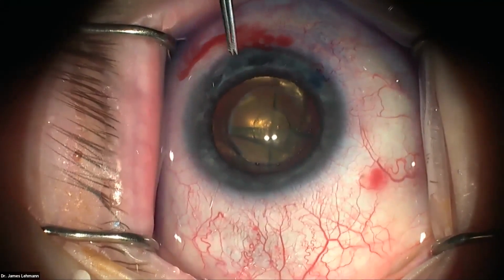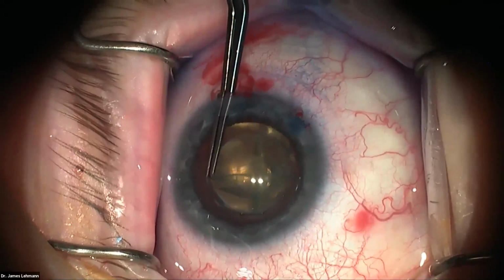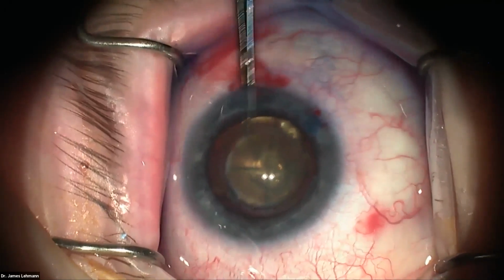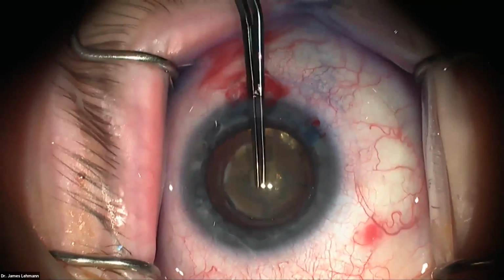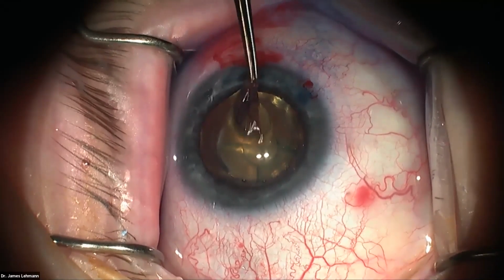Now, we've already made the capsulotomy, but we like to remove it here with Utrata forceps so that we can make sure that it was curvilinear and continuous. So you can see here it's freely mobile in the anterior chamber, and we'll remove that. You can see it's here on the cornea.